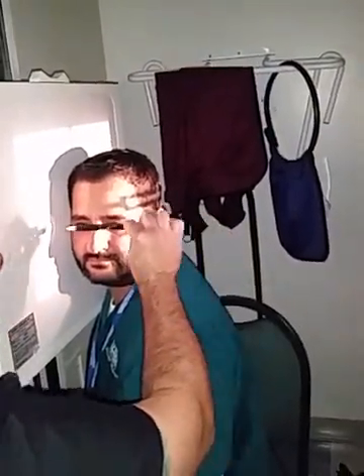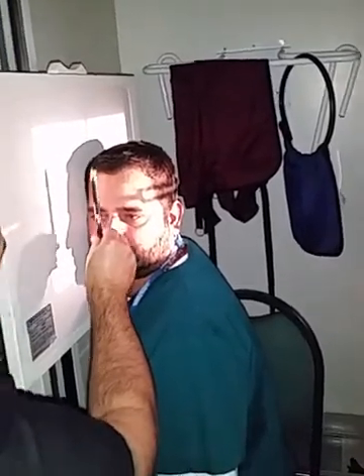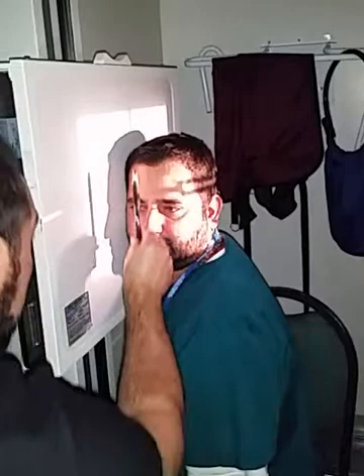So now you can look at it and see that he's lined up straight, right? And the other way that you can check this is you can also check your IPL and your mid-sagittal plane. Here's his IPL, right? It should be perpendicular to the IR, and there's his mid-sagittal plane, right? And it should be straight up and down, okay?